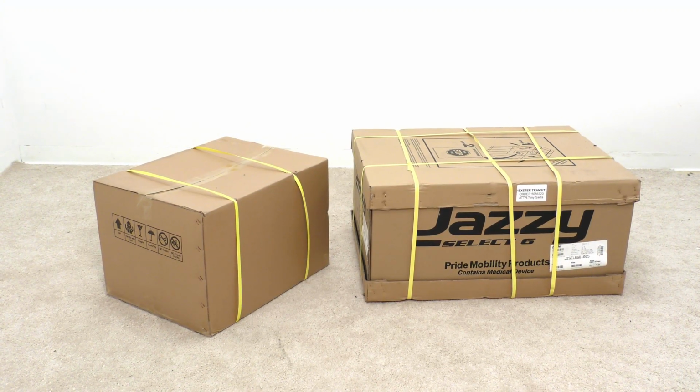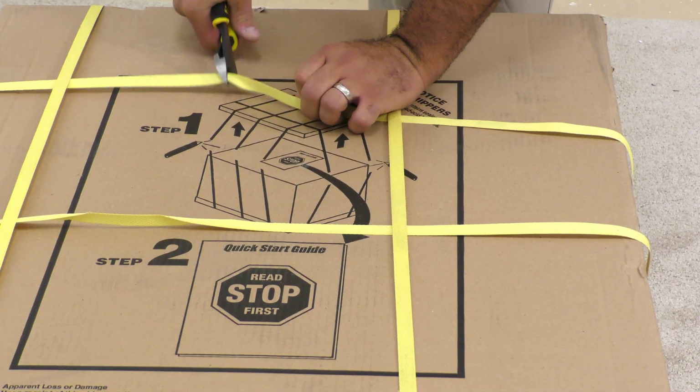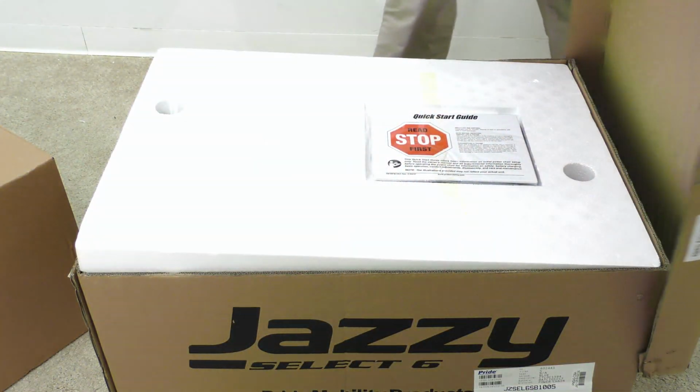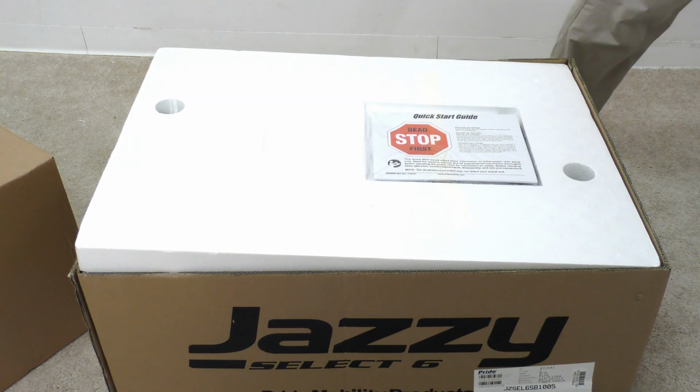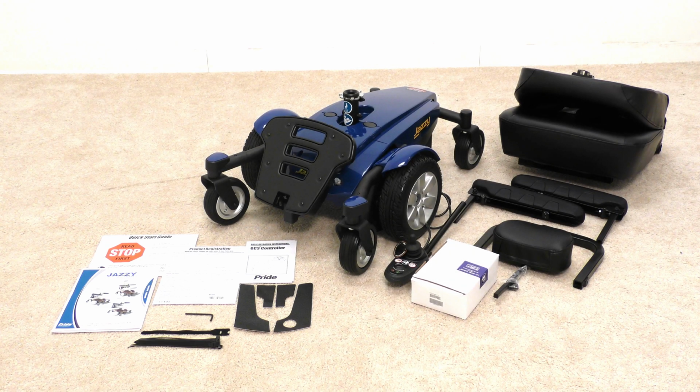When your Jazzy Select 6 arrives, it will be in two boxes, one for the base unit and the other for the seat. Cut the bands with a pair of cutters and open the boxes. On the top of the packaging, you will find the owner's packet and the quick start guide. The owner's packet will contain the owner's manual, wire ties, 4mm Allen wrench, and optional scuff guards. Once you have removed all of the components from the boxes, you will be ready to assemble the unit.